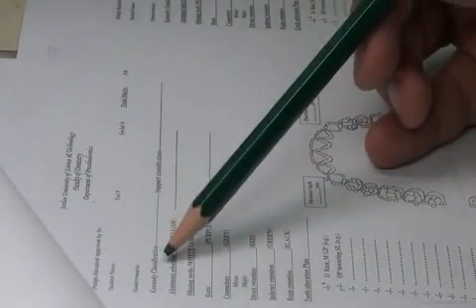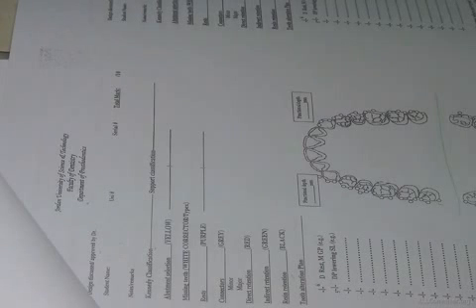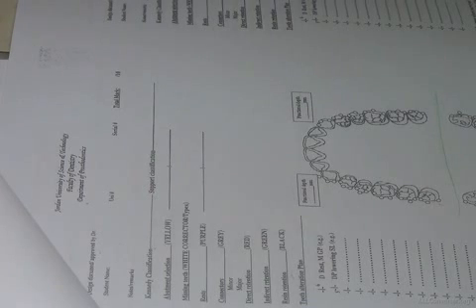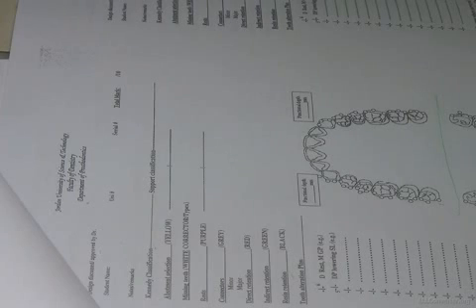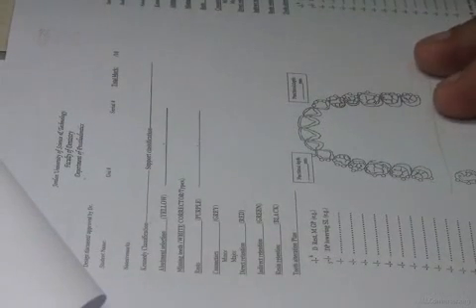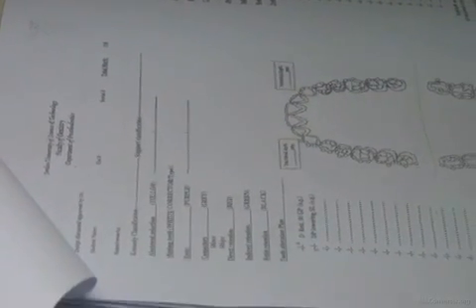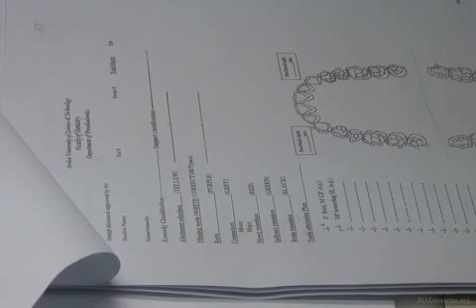Then we're talking about the Kennedy classification. Why do we need to fill in the Kennedy classification? Once you fill it in, you immediately understand, for each design, when you're talking about the Kennedy classification, you'll immediately envision a design in your mind, okay? It's very important because in this we also take into account teeth that we will extract later. It's very important that you try to correlate between the Kennedy classification and what my design will be. Provisionally, they are communicating with each other.